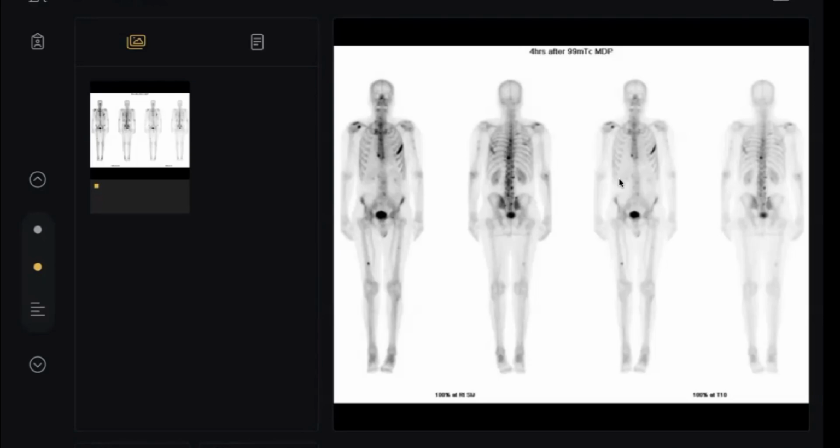If your oncology colleague or urology colleague asks you about this patient, he wants to do a PET CT. He has been proven to have prostatic cancer. What would you advise about the PET CT? Which type of PET CT?